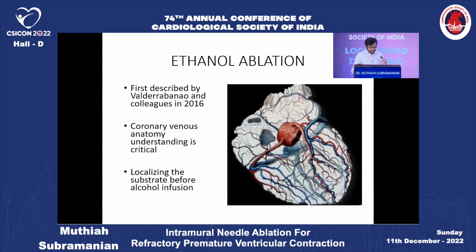The second way is, so let us leave the myocardium. You have intracoronary arteries and your coronary venous system. Now most of these arteries and veins go deep into the myocardium, and both of these approaches have been used to see if you can map and ablate within the arteries and the veins to reach these deeper structures.